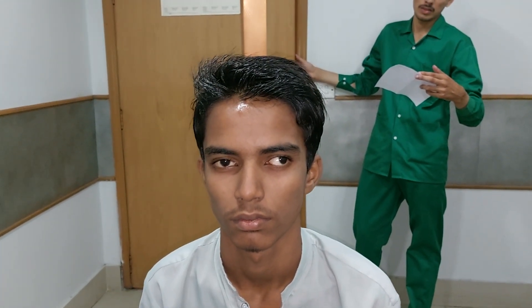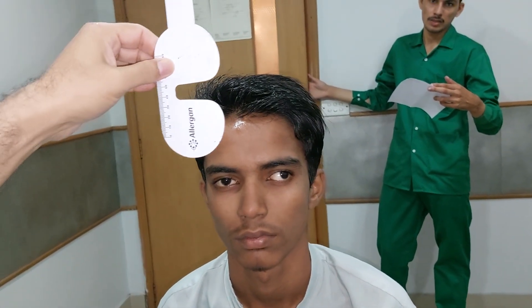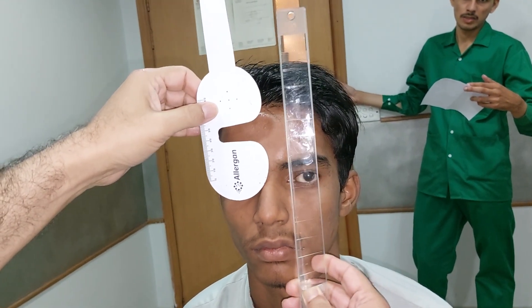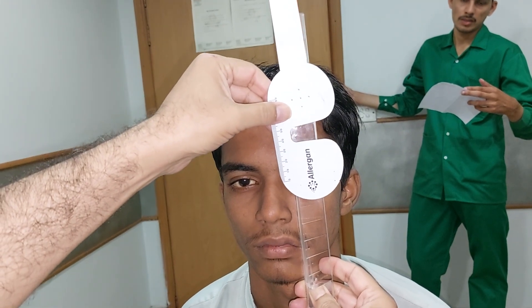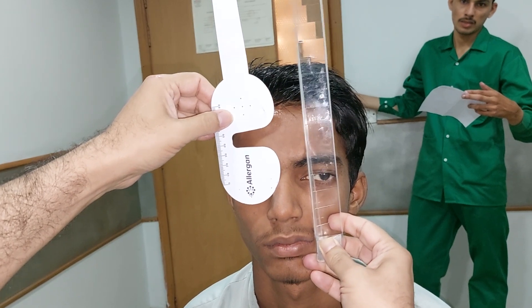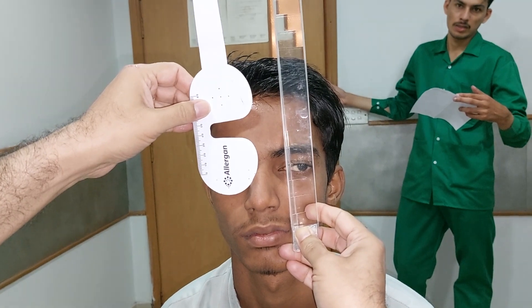Now I will measure it with the prism bar. On the Hirschberg, this is approximately 25-30 degrees or about 40 prism diopters. I will put the prism bar and do the alternate cover test, and I will note the point where there is no movement of the eye.